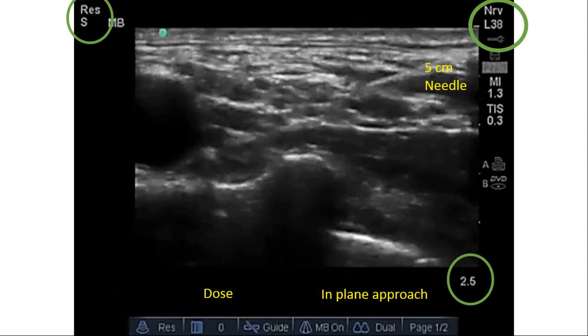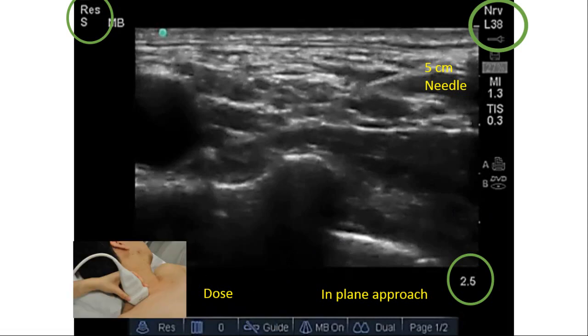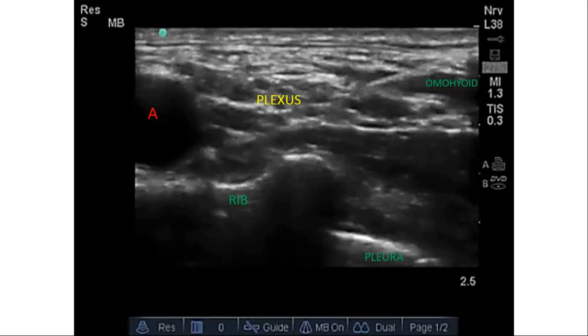The machine setting uses a linear high-frequency probe in resolution mode. Depth commonly used is two to three centimeters but can be increased. The needle is a five-centimeter short-bevel needle, used in-plane from lateral to medial. The drug volume generally used is 20 to 30 ml of local anesthetic.